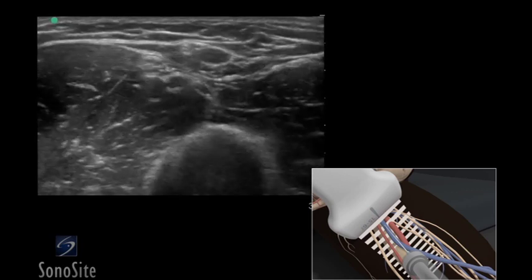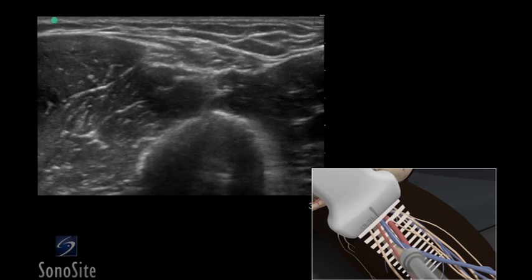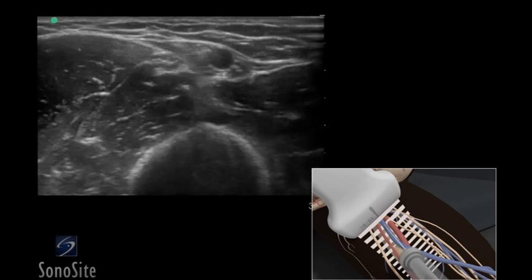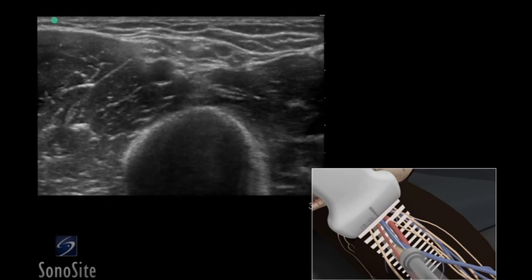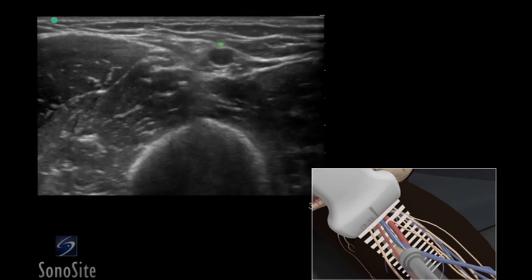When the needle tip appears, the transducer should be advanced a short distance to follow the tip of the needle trajectory and stay in advance of the needle entry. The needle is slowly advanced under direct ultrasound visualization until the tip is seen to indent and then puncture the basilic vein.